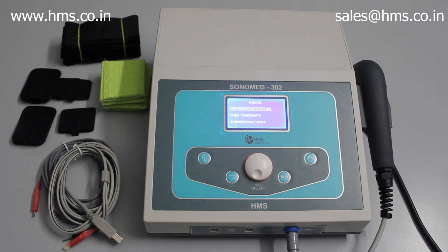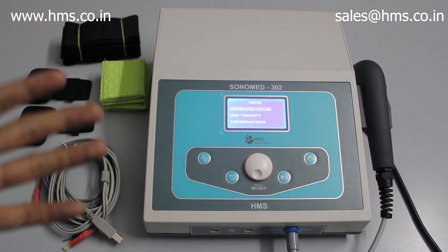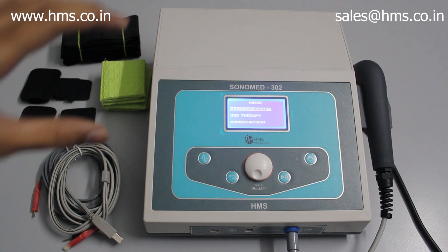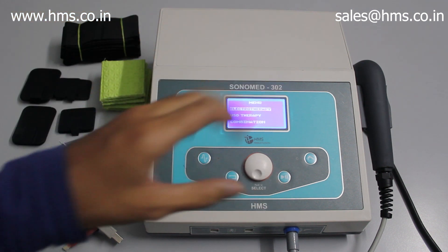This is Sonomed 302 from HMS Medical Systems — our new launch. This equipment has both ultrasound and electrotherapy built into it. Under electrotherapy you'll have IFT, TENS, and Russian current. All three modalities are available in the Sonomed 302 along with ultrasound.